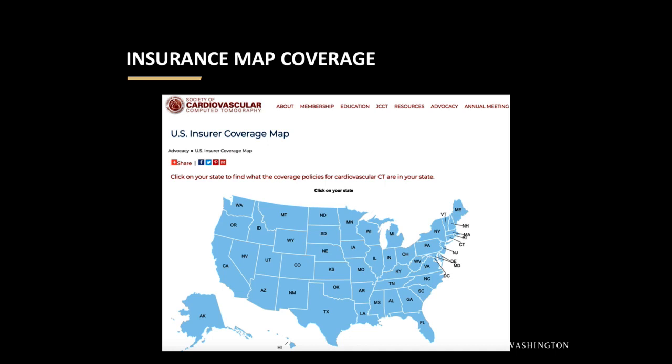Yeah, I don't know if we've actually looked at it in those populations. I think it's interesting because we think of using an exercise or functional stress test because we want to get the exercise component of it, but we don't exactly. And so I think coronary CTA certainly would be something to think about. I guess my question would be, if they're truly low intermediate risk, I think coronary CTA could be an option, but I just don't know really the data in coronary CTA for a transplant patient or for the preoperative patient.